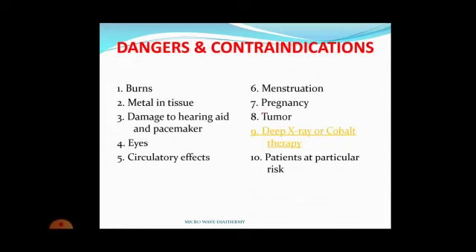In case of deep X-ray or cobalt therapy, definitely after this therapy there will be devitalization of the tissue. So it is advisable to avoid microwave diathermy, because this devitalized tissue may not be able to tolerate it and it may have adverse effects. Now, if the patient has just gone for an X-ray for diagnosis purposes, like one or two times, it is not a contraindication, that is routine. But we are talking of deep X-ray therapy, which is given for cancer.